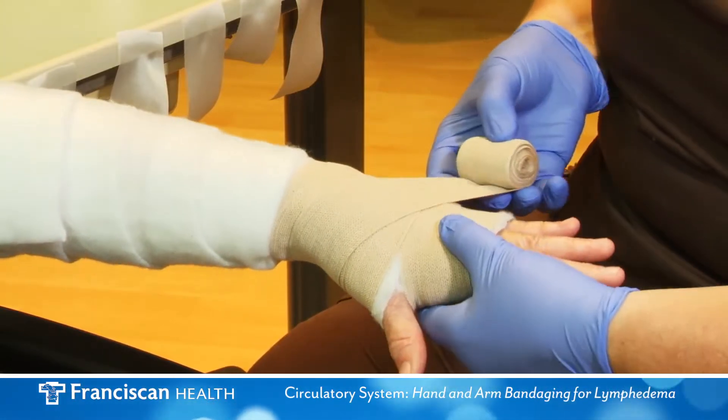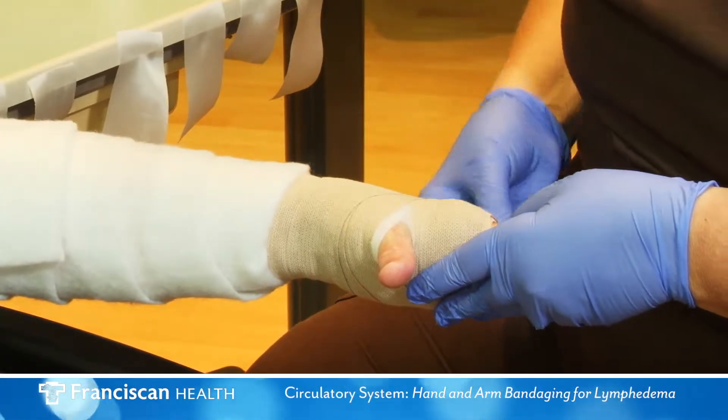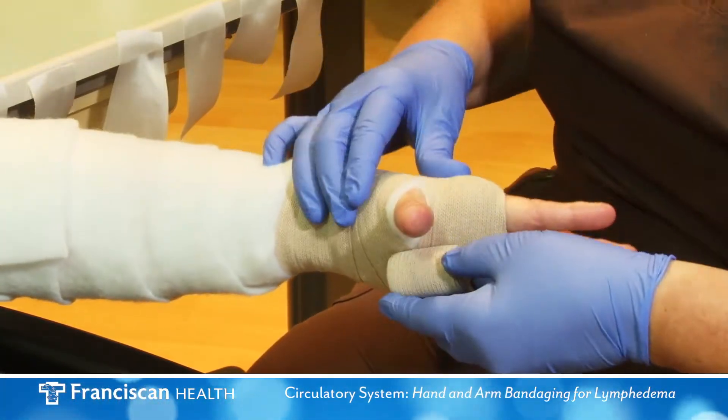You may have extra bandage left over. Continue with the extra bandage onto the forearm wrapping in a spiral fashion.